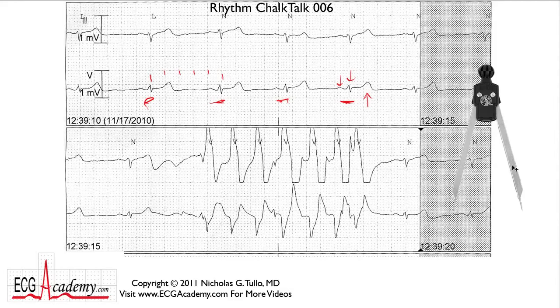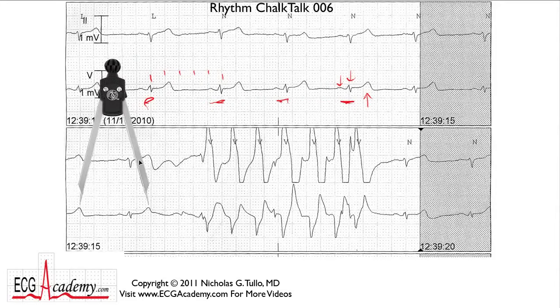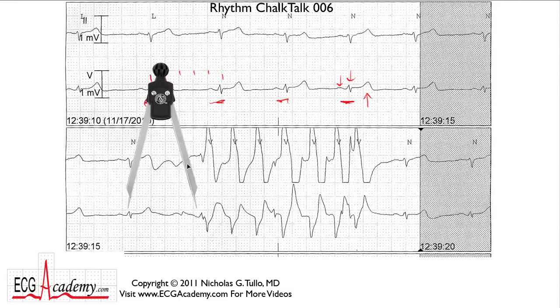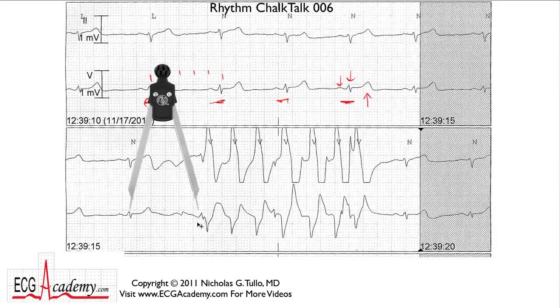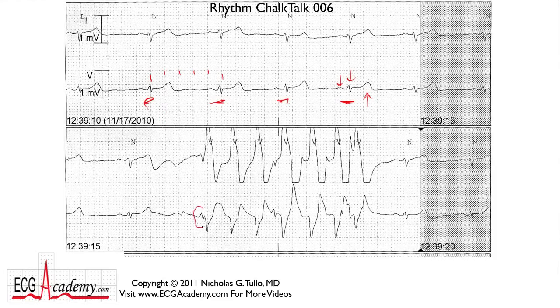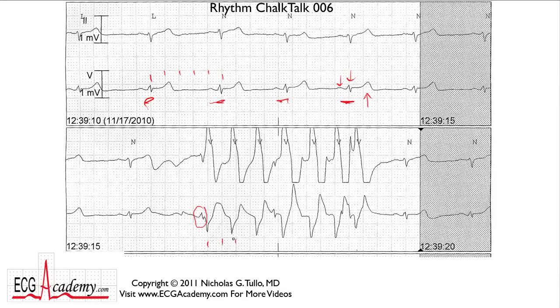Now let's get to the second strip. If we look at this T wave, the T-to-T appears to be regular. If you place the caliper on this QRS complex, you can see there seems to be a QRS right here that is probably on time. Then you have what looks like seven beats of a rapid, irregular looking signal with a rate — counting off 300, 150 — of about 165, maybe 170 beats per minute, but it's grossly irregular. It comes down to 150 here. You're not really sure what it is, but you might think this is a run of non-sustained ventricular tachycardia.